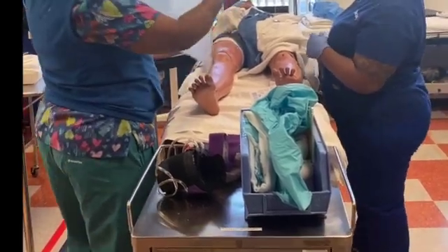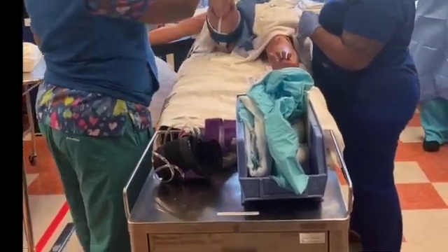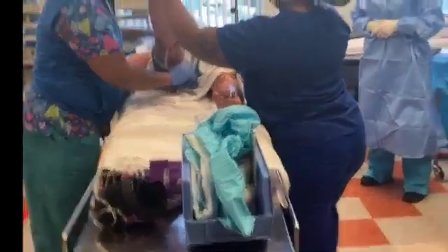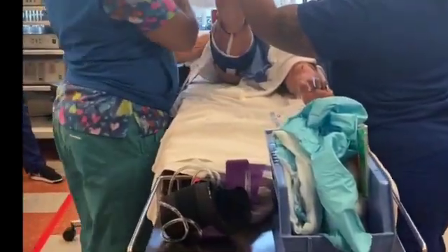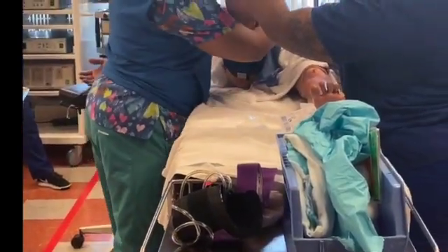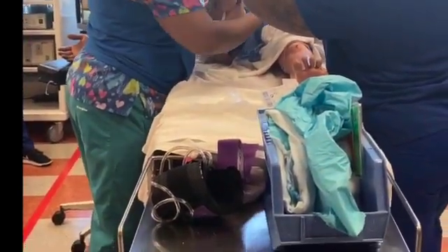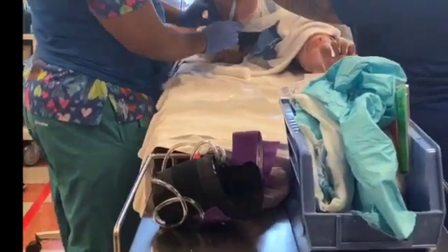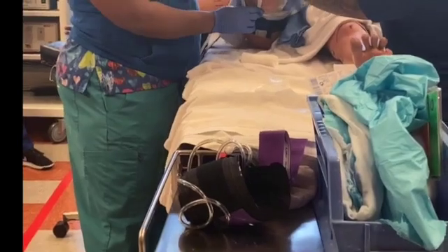So the other thing that we do for this, can you hold this for me? Is we'll wrap this around. You can go ahead to the front. You can? Okay. And then this one we would have to use 2. But it just goes to protect it. There's another layer. So you'd have one this way and then one on the bottom.